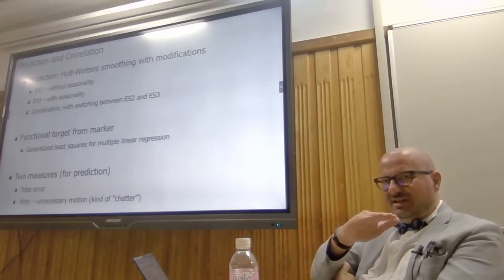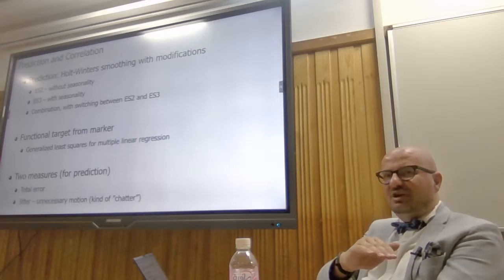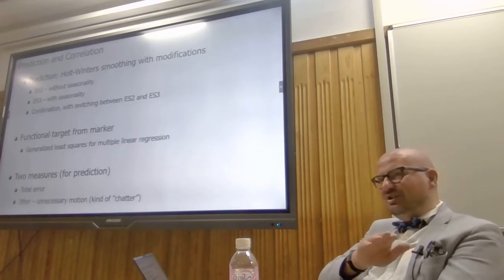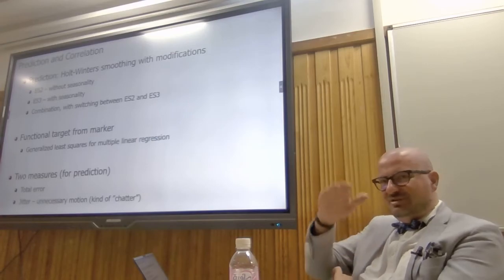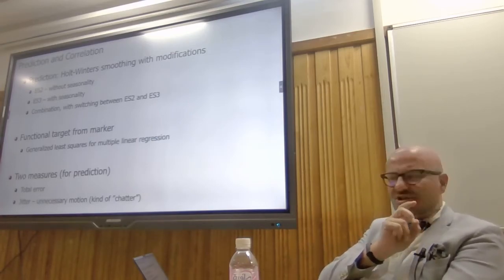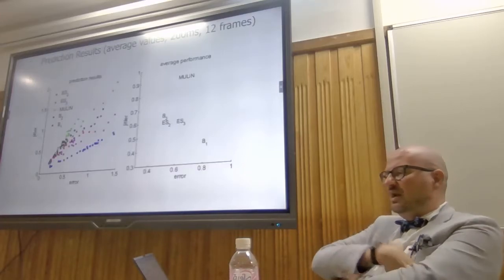Because it moves up, it has to stop, it has to go down. And the motion could be like 3 millimeters. So we did not break this couch, but it was making a very strange noise when you had all this jitter all the time, like chattering. In some cases, it's called chattering as well. So we wanted to minimize this as well.